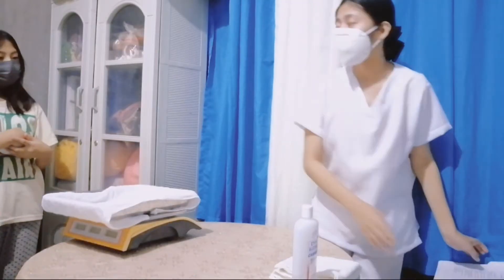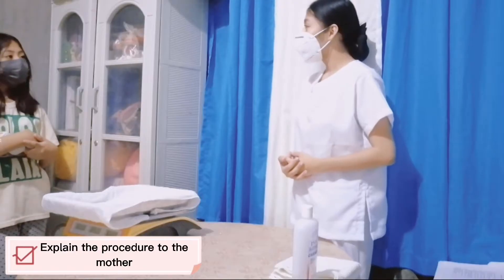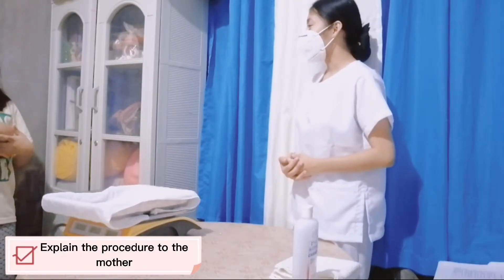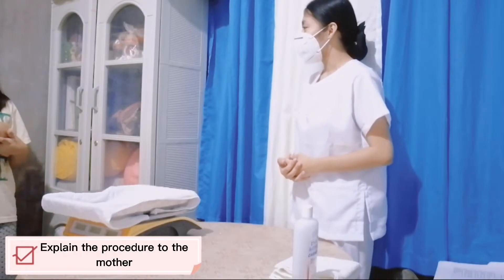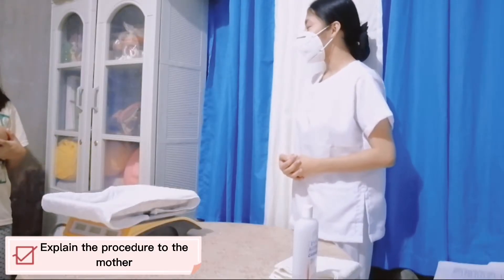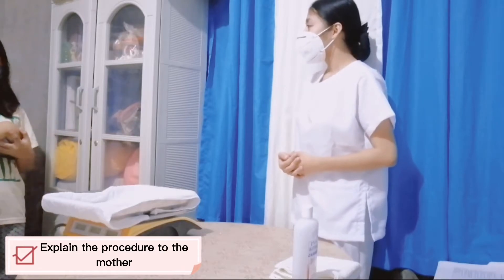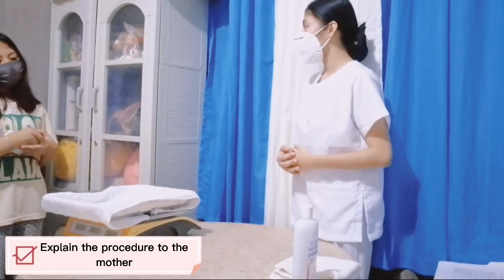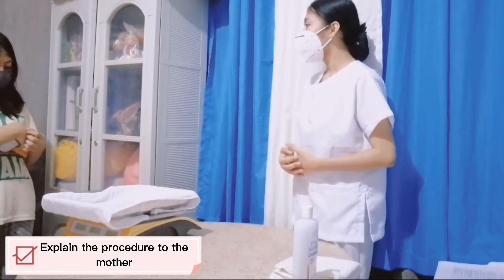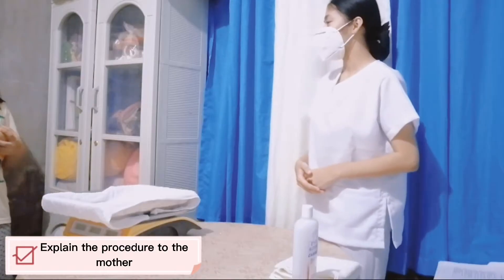So ma'am, I will first explain the procedures to you. Today I will be performing anthropometric measurement. I will measure the baby's weight, height, the head circumference, chest circumference, and abdominal circumference. It is for us to know and determine if the baby's body is within normal measurement and to determine if there are some abnormalities with the baby's body.